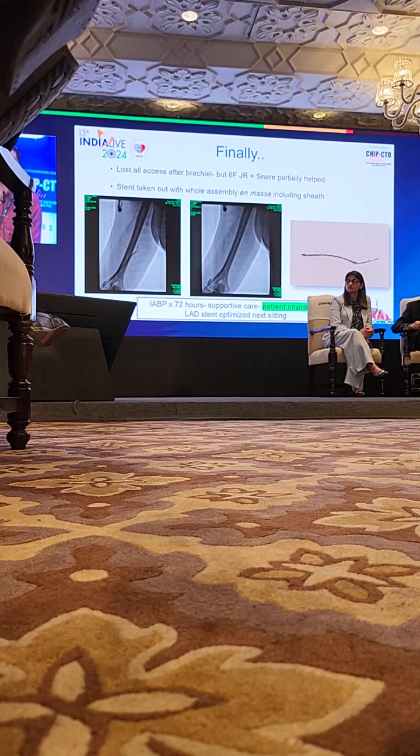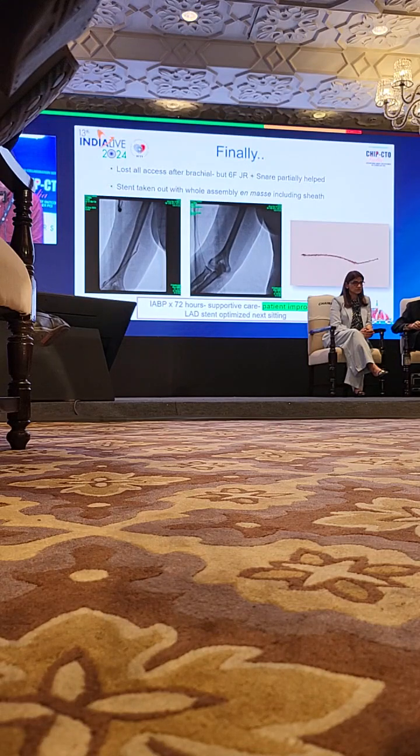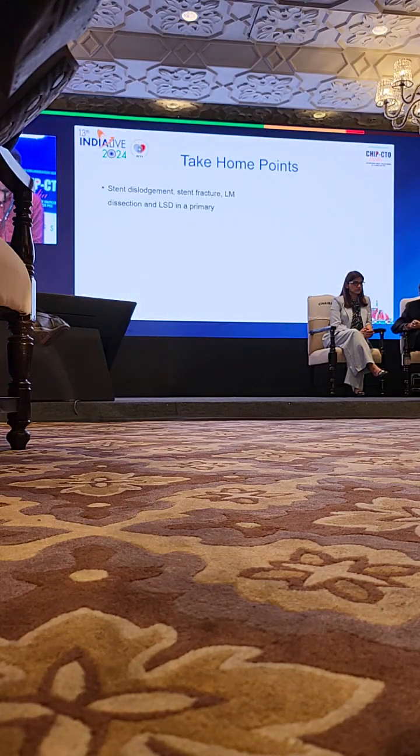We called her back 2 days later, optimized the LAD stent, the circ ostium was clean, it had healed then, and she went home okay. She's currently doing well. So take home points: stent dislodgement, stent fracture, LM dissection, branch vessel loss, circ loss, and longitudinal stent deformity in the primary PCI. Size mismatch, one size fits none. So never try to squeeze one stent in when there is a clear size mismatch.